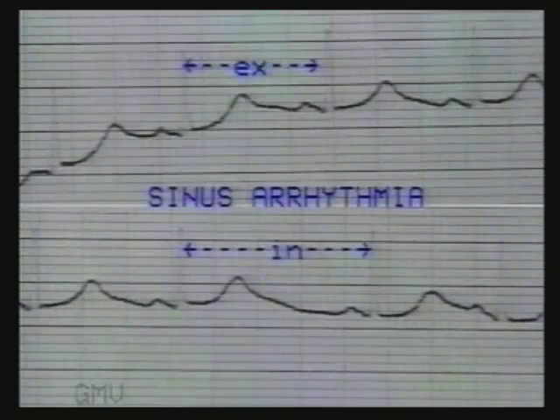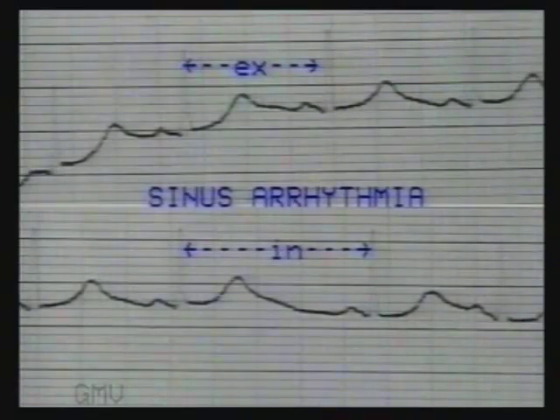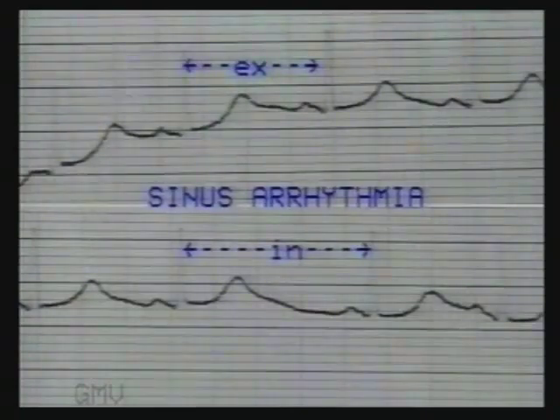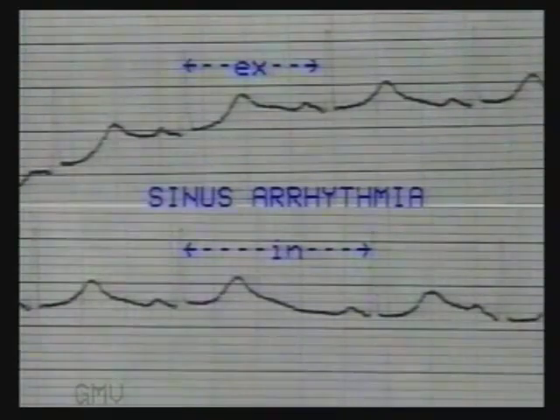In this ECG, which is a continuous strip, the RR interval varies from 16 small squares in expiration to 22 small squares in inspiration. But you will note that all PQRST complexes are normal. Each QRS complex is preceded by a P wave with fixed PR interval, indicating sinus rhythm.